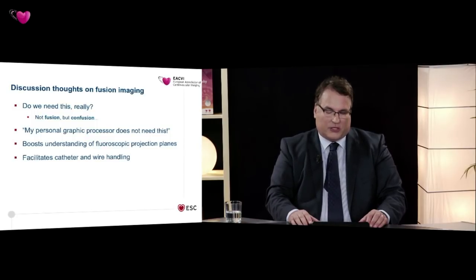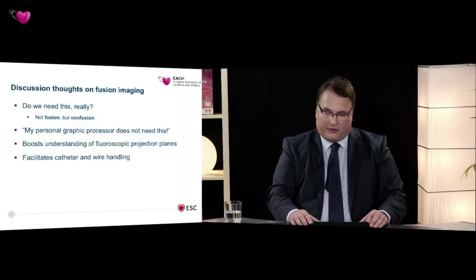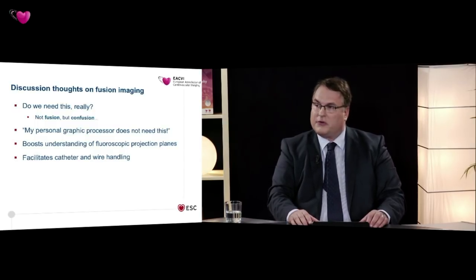So one of the questions here that relates to your talk, Felix, is: is this fusion image accurate? Is this technique needing a breath hold? So this is one of the viewers that is interested in this information. Can you elucidate on this?